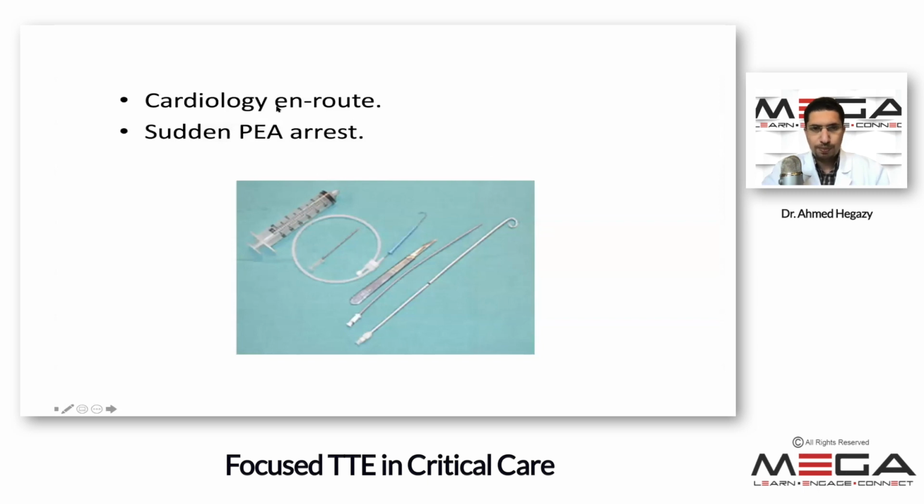So what did we do? We called cardiology. I usually call cardiology for pericardiocentesis because they do this procedure more often than we do, and it is a very high-risk procedure. When you go in with your needle, the RV is very close by. You usually don't have a big safety margin. And if you poke a hole into the right ventricle, it will start to bleed, and it will make the tamponade worse. Because it has a very narrow safety margin, these procedures are very high risk, and I usually recommend that cardiologists actually do them.